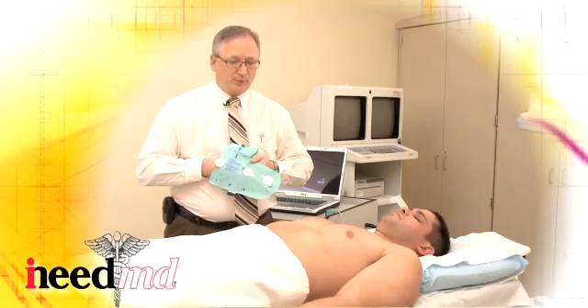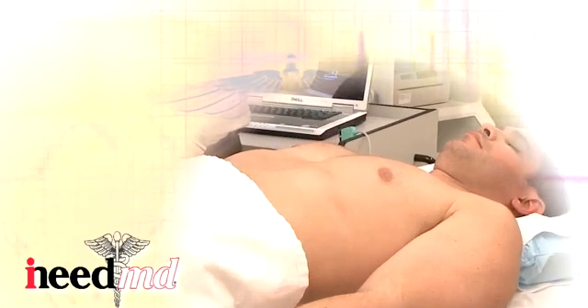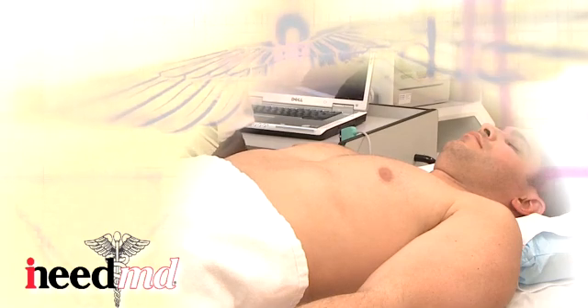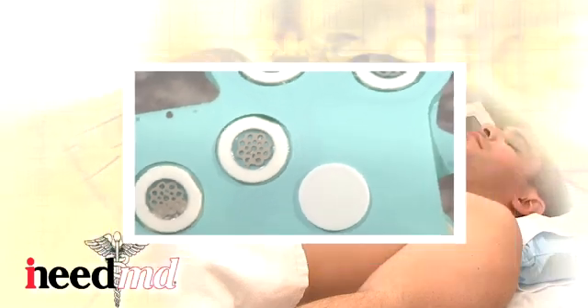Prior to applying the glove, the patient should be prepped. The chest should be cleaned free of oil, lotion, and powder, with any excessive hair removed. If hair cannot be removed, then add ECG electro jelly over the glove electrodes before applying the glove to the chest.